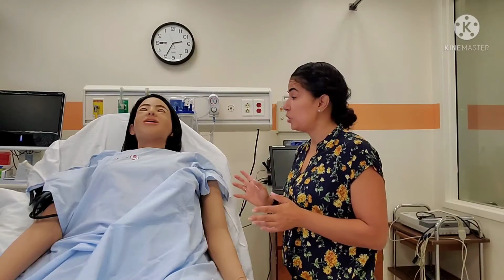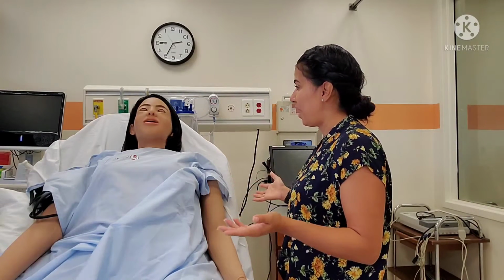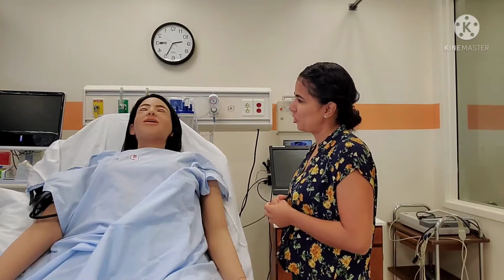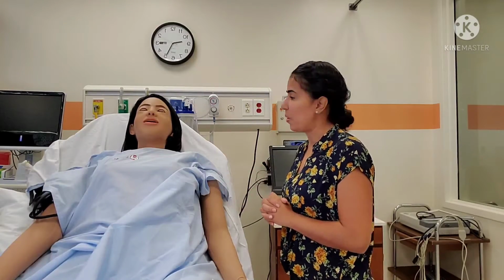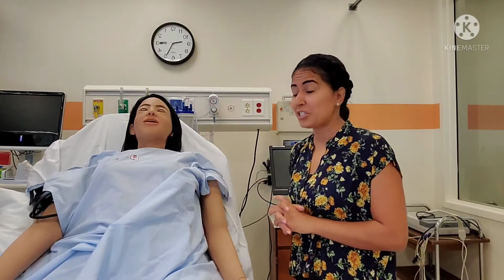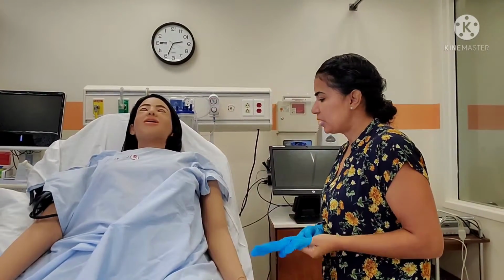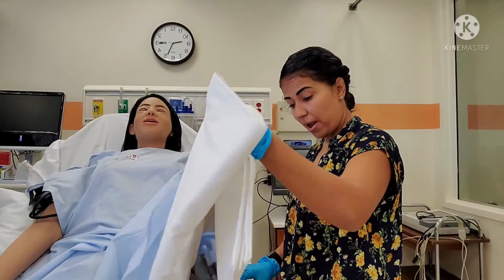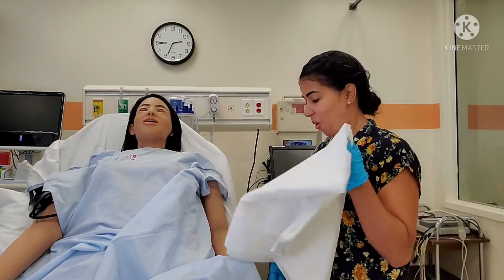Now, what I do want to do is look at your chest tube and make sure that everything looks good. Most likely I'm going to be looking at it a lot through my shift just to make sure that everything looks the way we want it to look, okay? All right, so let me go ahead and grab some gloves. Okay, so I'm going to put a blanket down just because I want to give you some privacy. You are on YouTube after all, right?